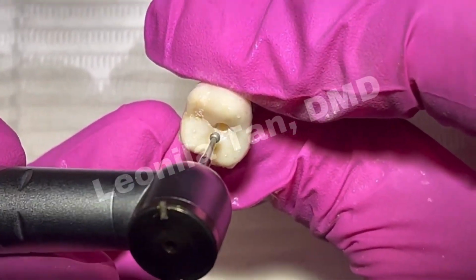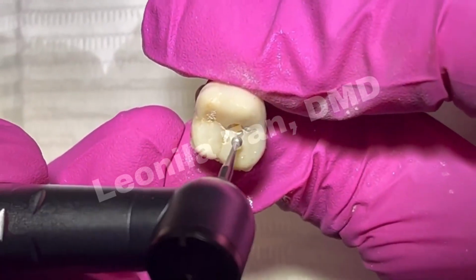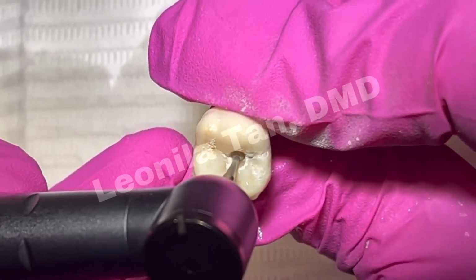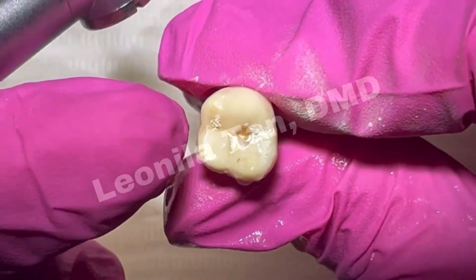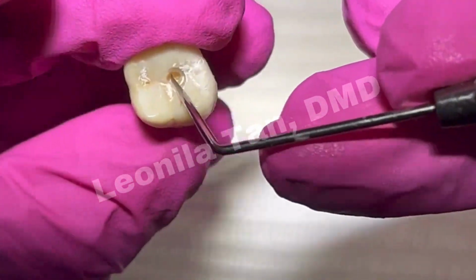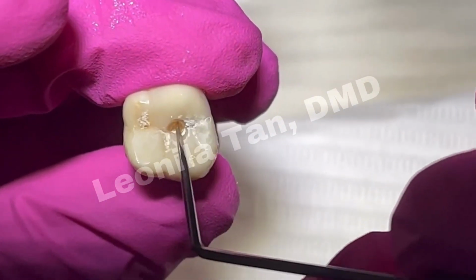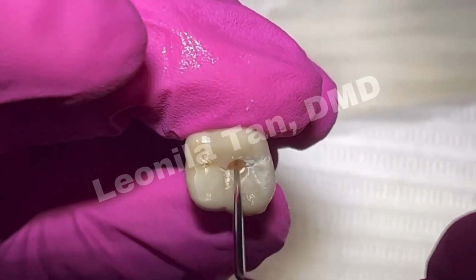You use a touch and go motion because you want again to locate that drop. So notice I am avoiding touching the marginal ridge. So as you go deeper, you want to always check with the Endo Explorer. So notice your angulation. The burr is avoiding that mesial side and it is directed towards the palatal.